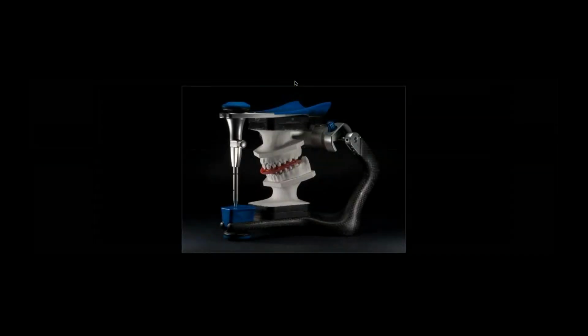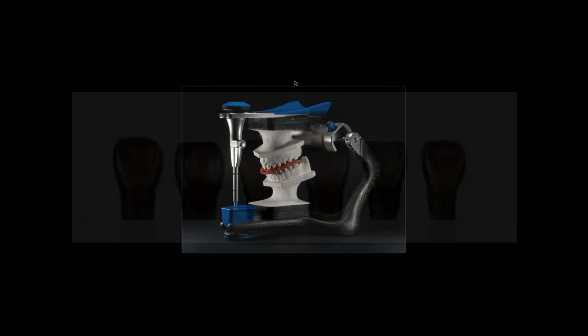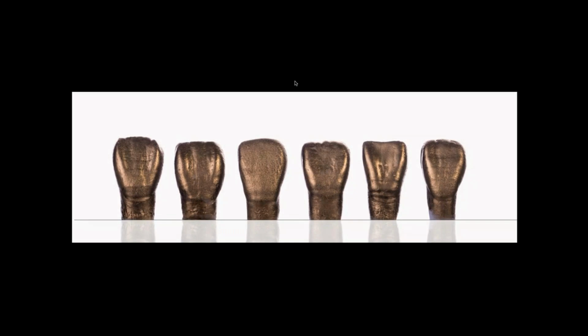Okay, then I have the articulated model, and after that I start choosing what kind of shape I should do with this patient. You can see here in this slide that there are like 1,000 different incisal shapes. So almost every patient has a different tooth shape.